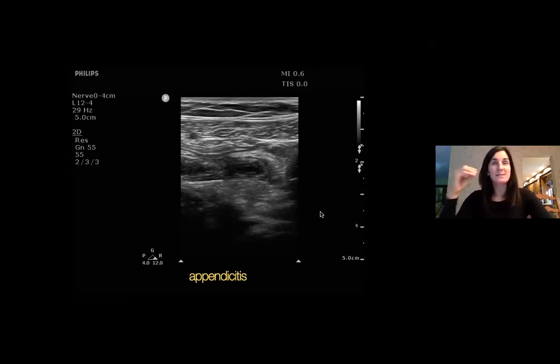But for me, as I always say with POCUS, I remove my cognitive load of diagnosis from that patient. I know what she has or what he has. I can pretty much certify that this person has an appendicitis. So I'm going to give him some analgesia. I'm going to wait for the formal ultrasound in the morning, or the radiology performed ultrasound, should I say, in the morning. And I'm going to just put them NPO. So right away, he's kind of in the box. For me, I don't need to pursue any advanced imaging right now. I know the disposition of that patient. So depending on where you work, it's going to be a little bit different in terms of the management.